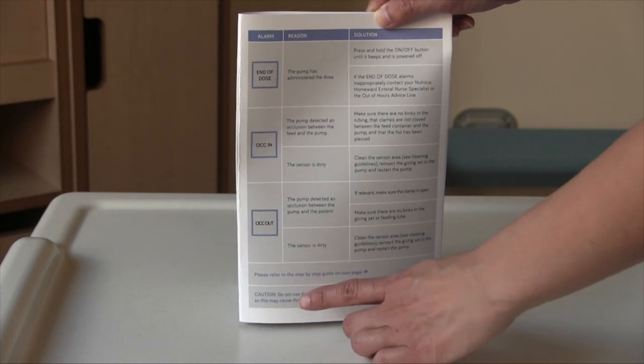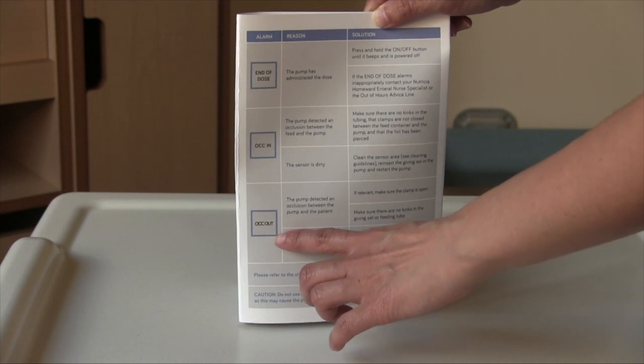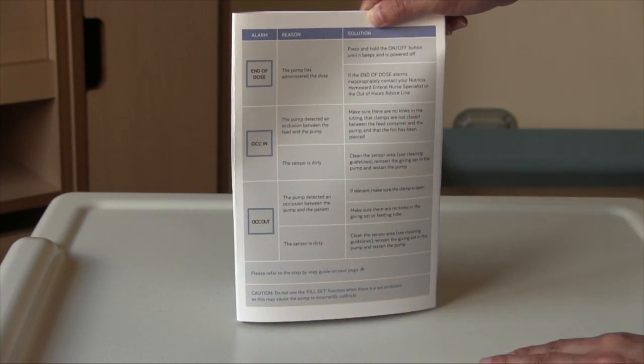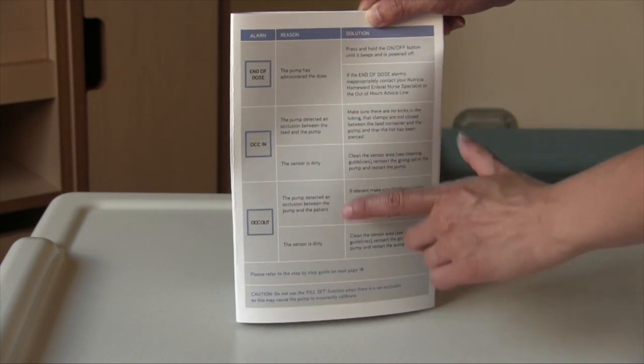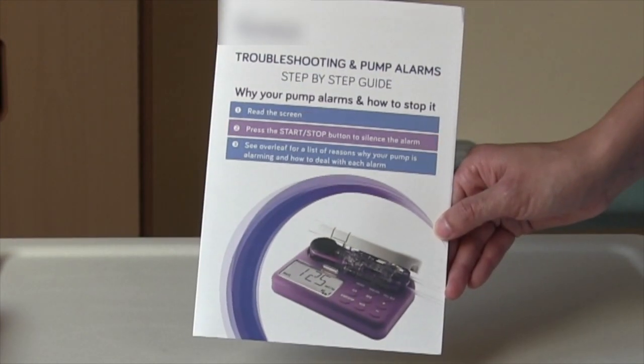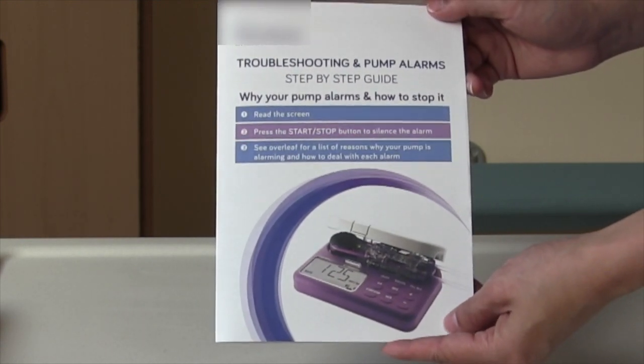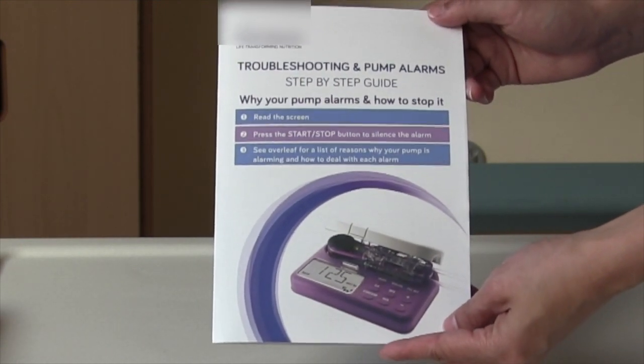Similarly, if the tubing coming out of the pump is kinked, it will say OCC out, which means occlusion out of the pump. And again, you'll have the reason and the resolution. Nutricia provides this troubleshooting and pump alarm step-by-step guide to troubleshoot any problems you may encounter.